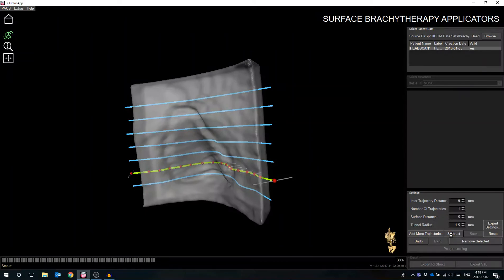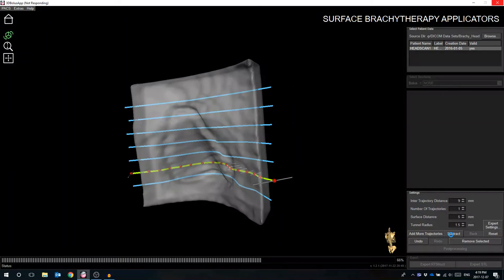the Subtract option will prompt the software to remove the points along the trajectory line to create a hollow tunnel for the source to travel through.